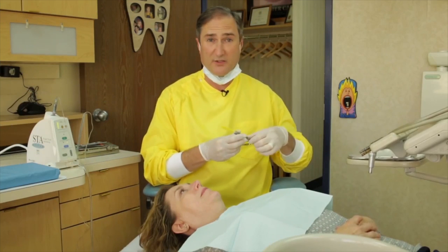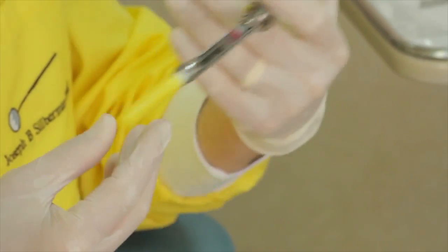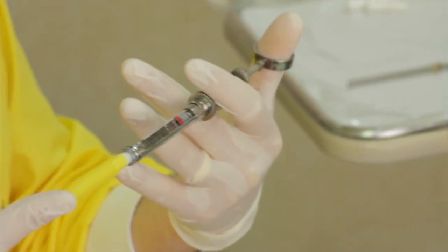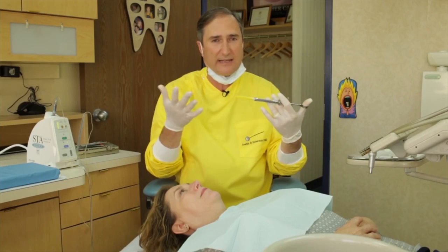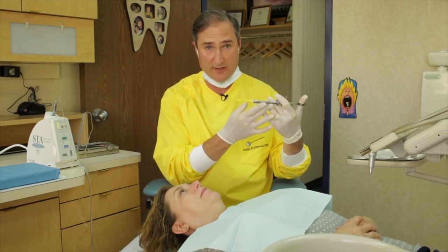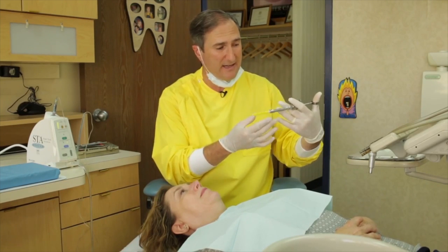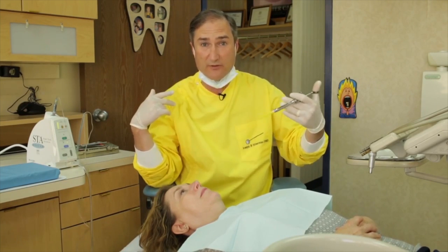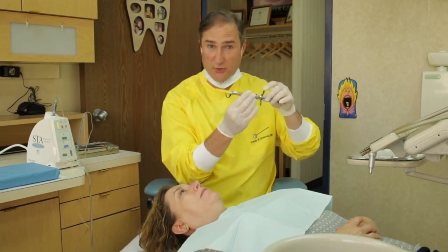In the old days, when I would make a tooth numb, this is what I would use. You put your thumb in here and now you've got the syringe that everyone hates — the syringe that I hate. I can't tell you how much I hated using this syringe. It was scary, the metal to it, and it's not really that easy to maneuver, frankly. But nowadays, I don't use this.